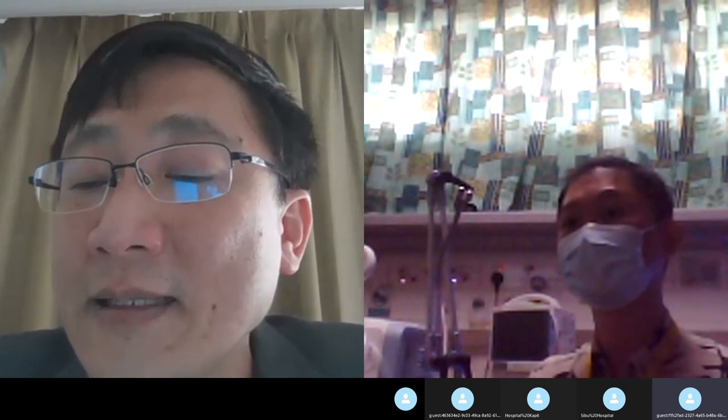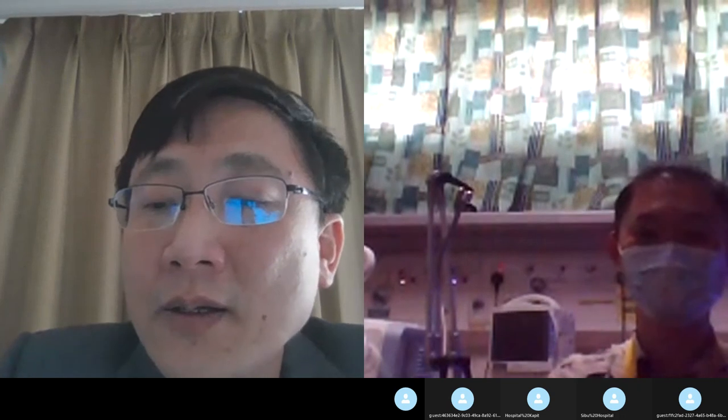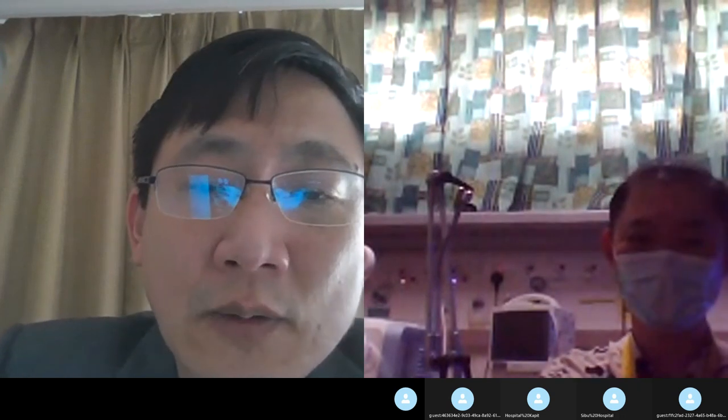The respiratory rate, huh? What's the maximum respiratory rate that we can set? In a bigger child, the respiratory rate will go on a normal physiological respiratory rate. As you remember, this is a time mode. In the time mode, it's basically a backup rate. For the backup rate, it all depends on the patient's age and size. For a smaller child, you want a backup rate of maybe 25 to 30, the neonatal age group.